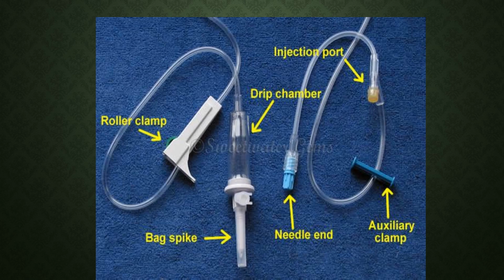So if you've got an IV running normal saline, let's say at 50 mL per hour, but yet you want to give some morphine IV push, you can give it IV push through that injection port. When you are giving a medication through an injection port, you always want to remember to pinch off the tubing above it. You want the medicine to go, and those injection ports are generally very close to the IV site. So there's not very much tubing between the injection port and the patient, because you want them to get that medication quickly.